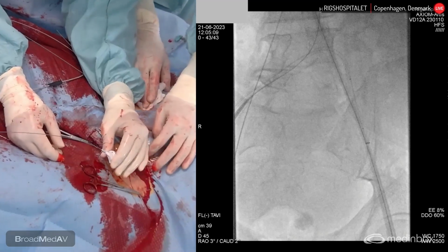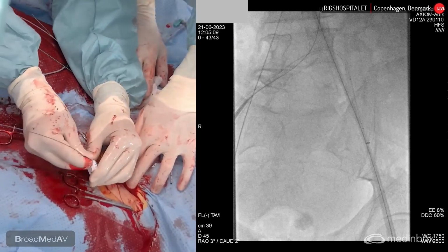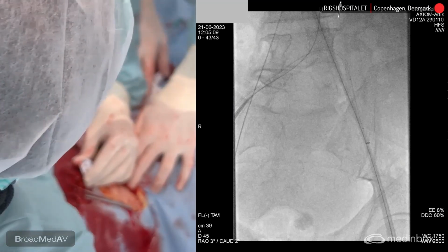Can I see? It's bleeding a lot around that Angio-Seal. Can I see? Just no, it's okay. All right. Yes, go on.